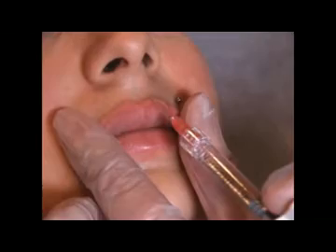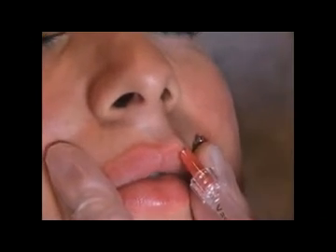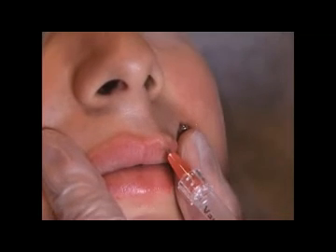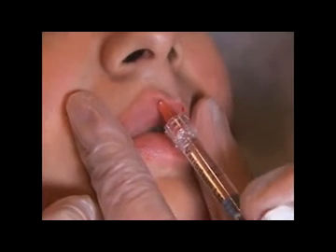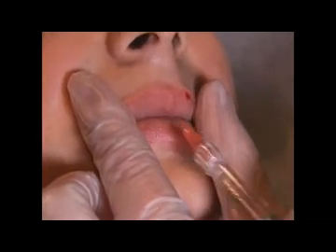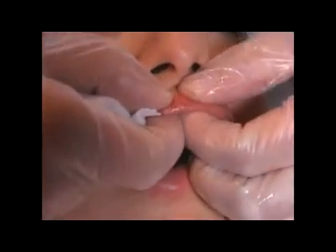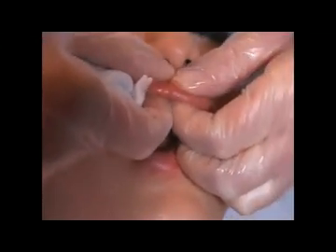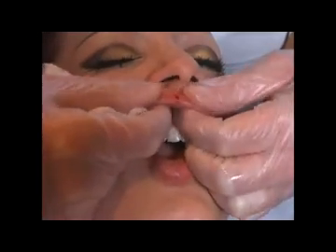What we can do is a little bit in the philtrum to make the pronunciation of the philtrum — I go just from the front, fix it, go in, and give a little amount along the philtrum. Same here on the other side. The massage in the lips is the most important thing. You take it between your fingers and make the massage — there should be nothing harsh between your fingers, then it's impossible that there will be a nodule.